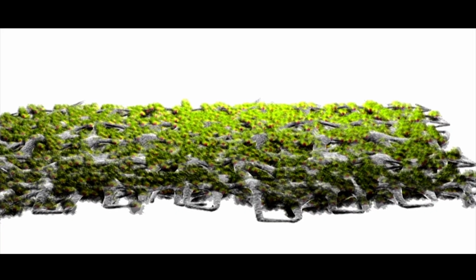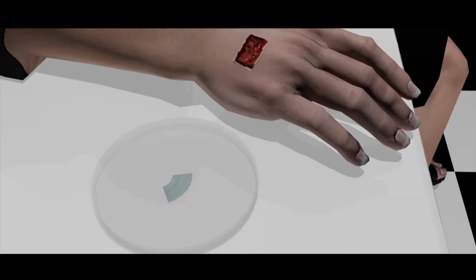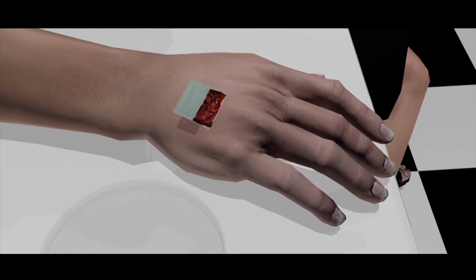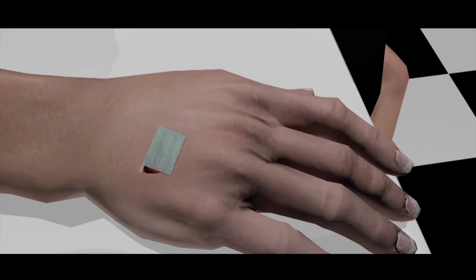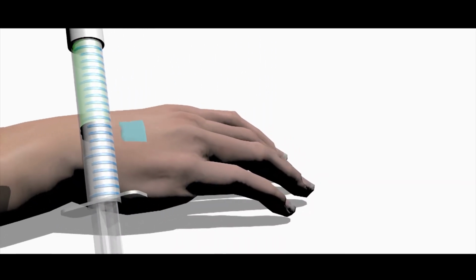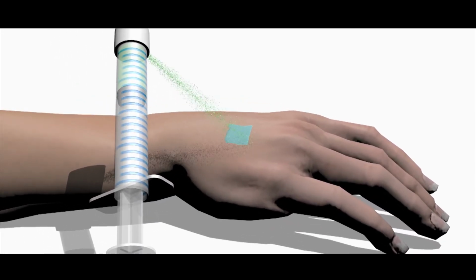These cells continue to multiply and infiltrate the material. The scaffold is gradually remodelled by the activity of the cells. Their enzymes break down the scaffold and replace it with an extracellular matrix. The material is now starting to resemble real skin. The surgeon places the scaffold onto the wound bed. Finally, an aerosol spray of lab-cultured skin epithelial cells is applied to the scaffold. After a few weeks, the wound should be fully healed.